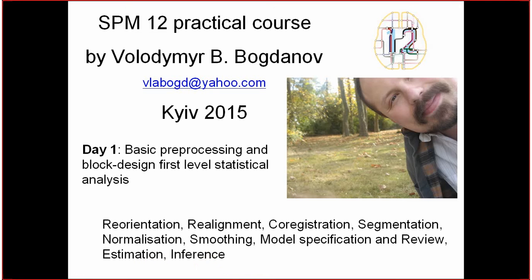At the moment, all those words can look strange and unclear to you, but I hope that at the end everything will be absolutely clear and useful, and you will be able to navigate easily through different steps of the analysis of the fMRI data. If you have any questions, don't hesitate to interrupt me immediately, and I will try to answer them as clearly as I can.